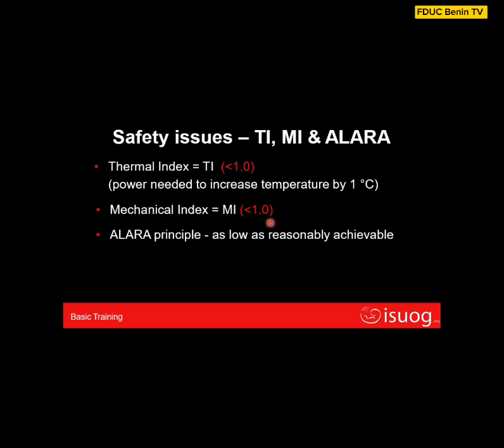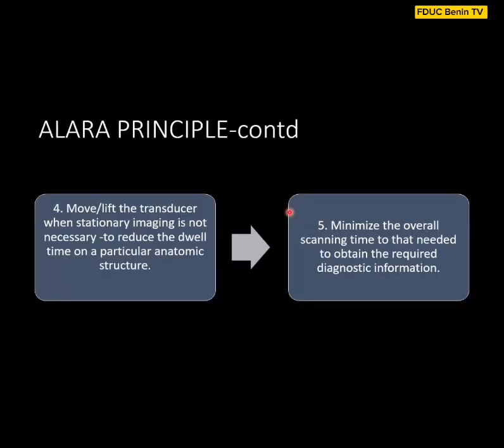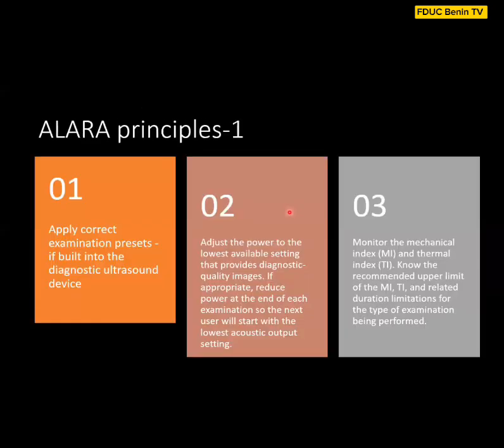One thing is very important: the ALARA principle, as low as reasonably achievable. If you don't need it, don't ask for the ultrasound. Some women want to do ultrasound every day, but we now say there is no need. So, ALARA principle: apply the correct examination.